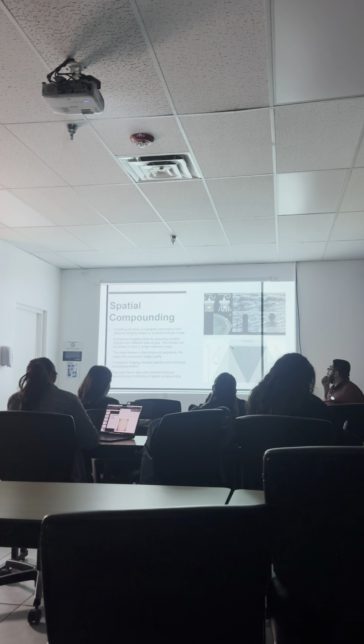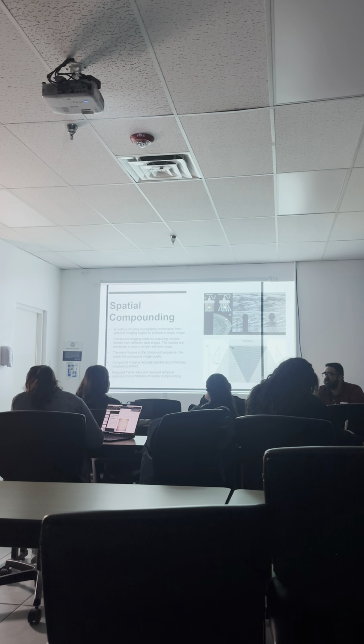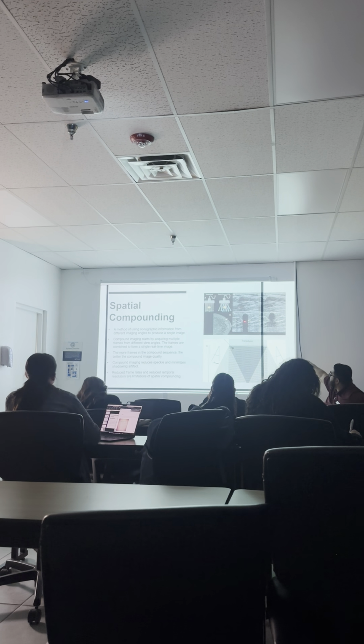Okay, now if we have less layers, what happens to our image? Less clarity. It's less detailed, right? So we get these gaps in between the tissues. You guys know what this is?